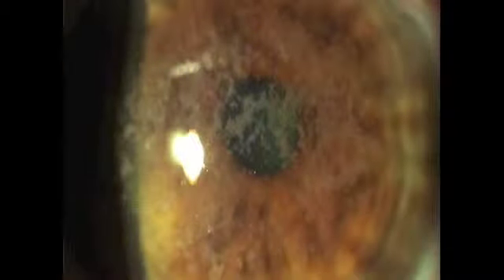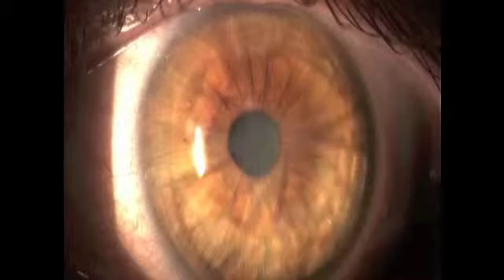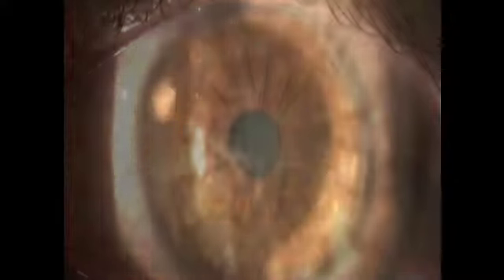In cases of corneal dystrophy like this, we combined it with lamellar keratectomy and cataract surgery at stage 1, followed by laser PRK at stage 2 to complete clarity and emmetropia. In cases of RK, this is a dense in-corneal scar that underwent straight laser to clarity and excellent refractive outcome. In this RK case, this was an on-corneal scar that was peeled followed by laser PRK to an excellent endpoint.